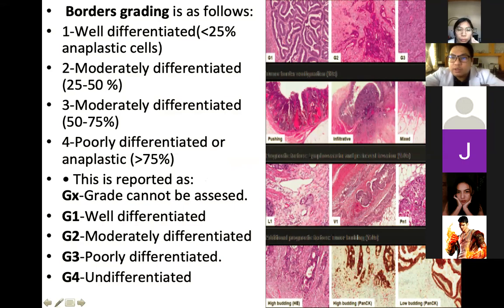Okay? Ito yung mga appearance class. Oh. This is grade 1, grade 2, and the grade 3. Okay, di ba? So if you look closely, you cannot distinguish these cells kung dito ka magsa-start. Okay? So, poorly differentiated ito siya. Okay?